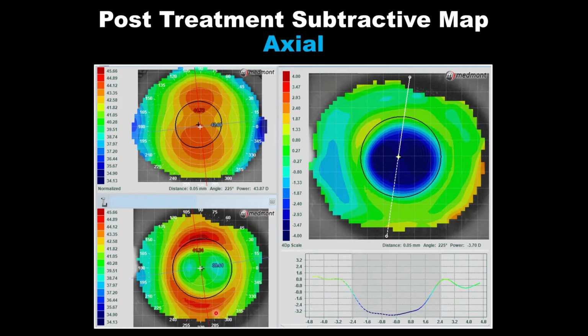Now, the other benefit of using a composite for your baseline, and we only need it for the baseline map, we don't need it for any post-treatment visit, is you always have that good quality reference point to compare pre versus post.